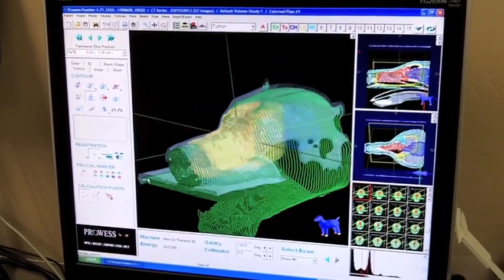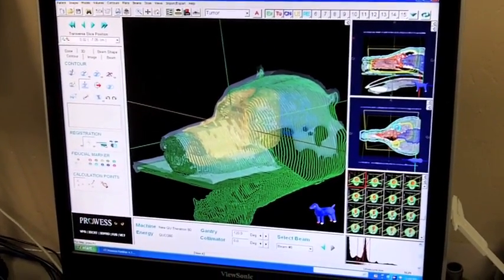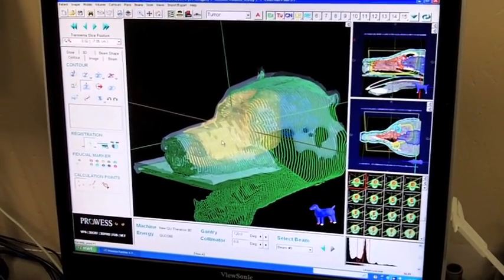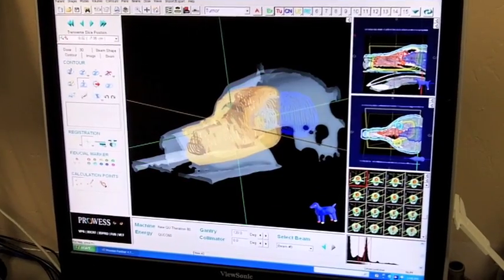Here's the external contour of a dog that has a tumor in his nose. And I'll take that off so you can see a little bit better.